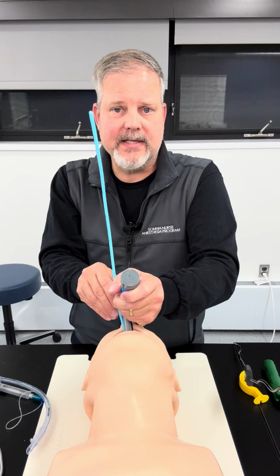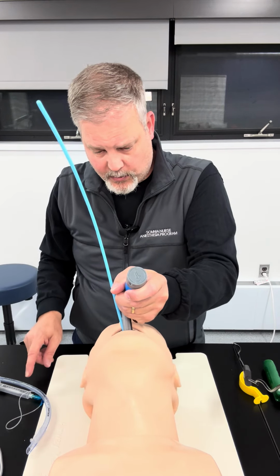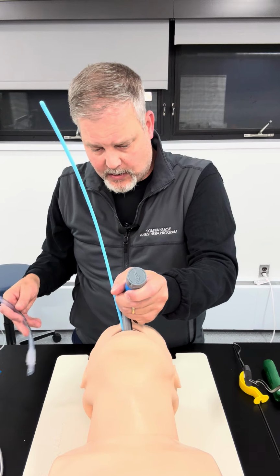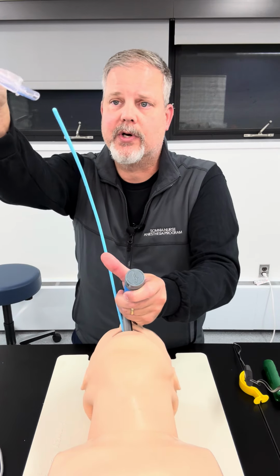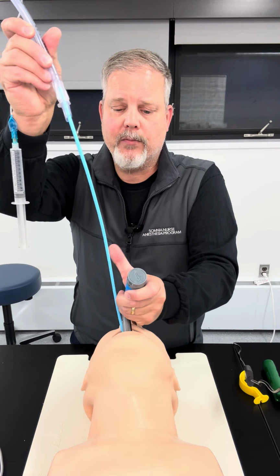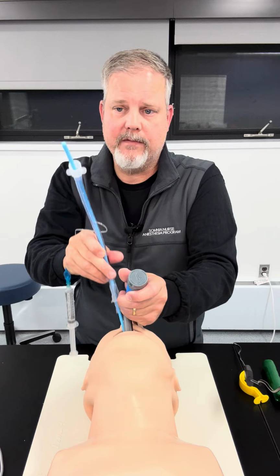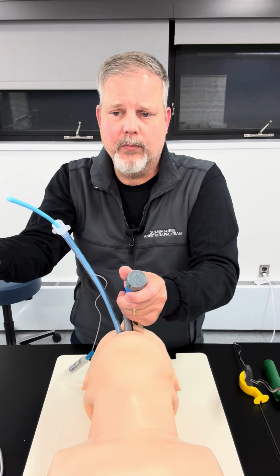Now, once I have this in the trachea, if I have an assistant with me, they're going to place, or if I don't, I'm going to place, this endotracheal tube over the bougie. So now we start sliding the endotracheal tube over the bougie, and you're usually going to have somebody with you at this point.